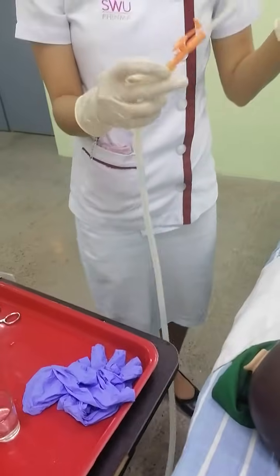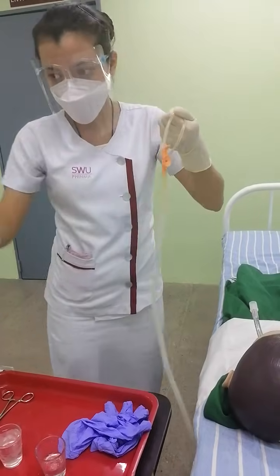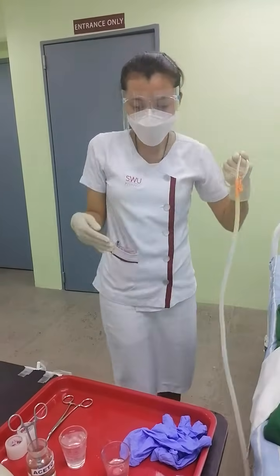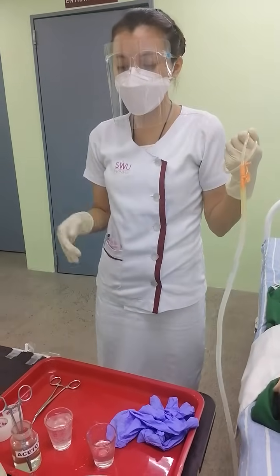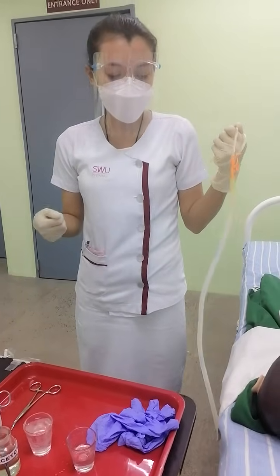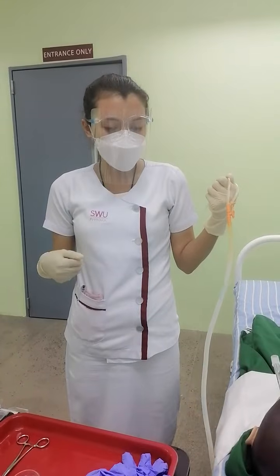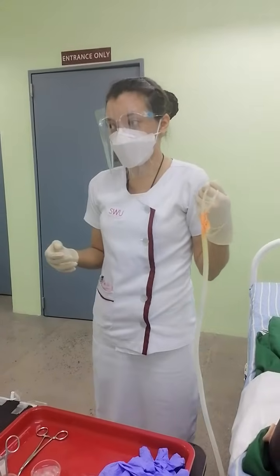After the procedure is done, I will turn off the suction machine, then dispose of materials, take off my gloves, do hand washing, and then document. The purpose of documentation is to ensure that the procedure was properly delivered to the patient for the safety of the patient and for the continuity of care.